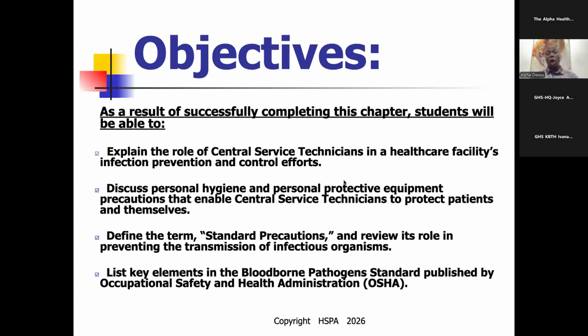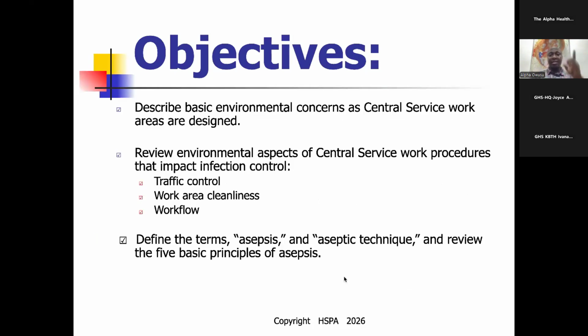So, eliminate and destroy all potential infection contaminants present on reusable instruments. That is prevention, right? Infection prevention and control, the goal of sterile processing. All that we want to do, that is our main job, right?